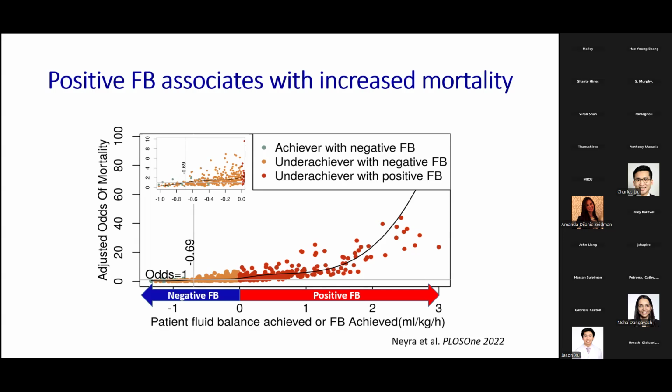This was defined as the prescription of CRRT including on average fluid removal of about 0.5 liters per day. So these patients were clinically assessed as being fluid overloaded, requiring CRRT, and clinicians wanted to remove fluids in these patients.